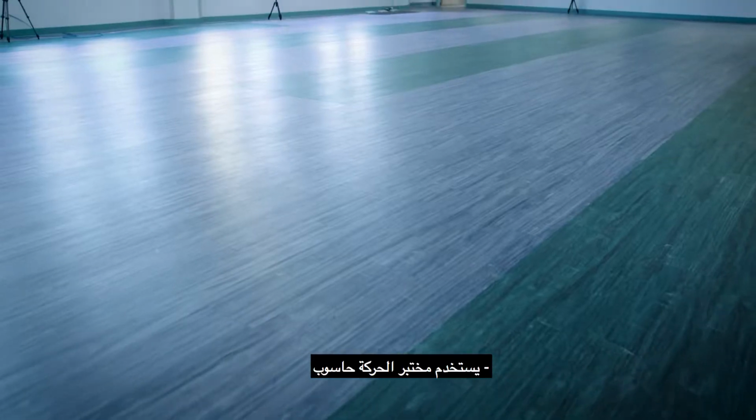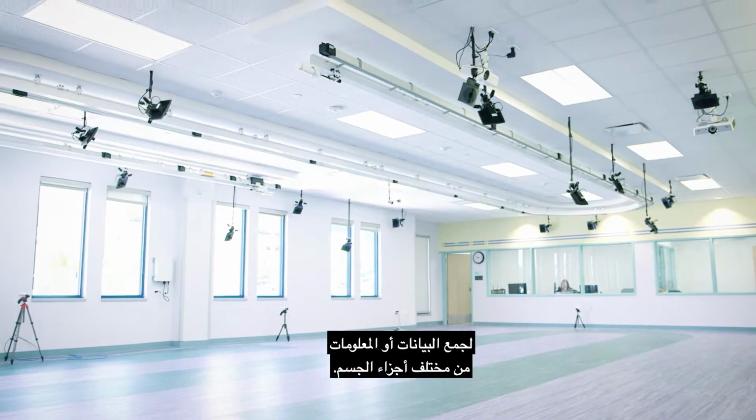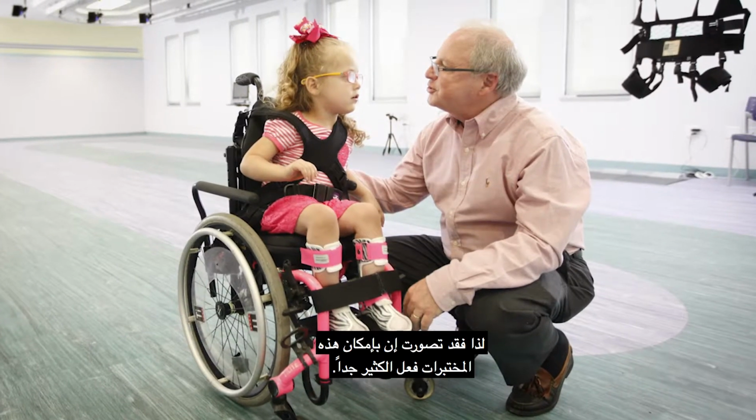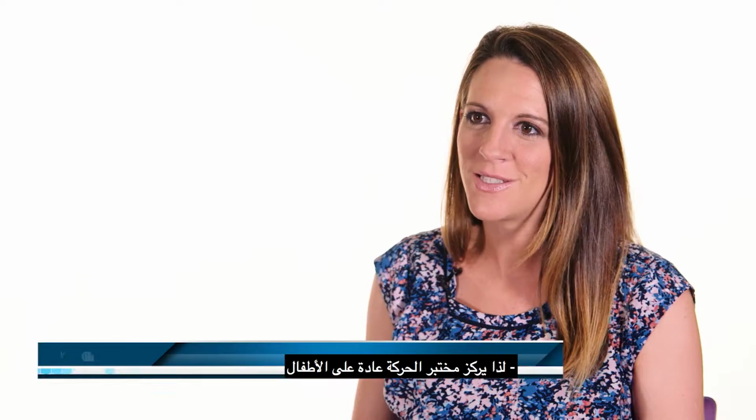A motion lab uses a computer to combine data or information from different body parts. Most gait labs are directed by orthopedists. Because I've always had this interest, especially in upper extremity function, I just thought there was so much more these labs can do. So typically a motion lab is focused on children with a diagnosis of cerebral palsy.